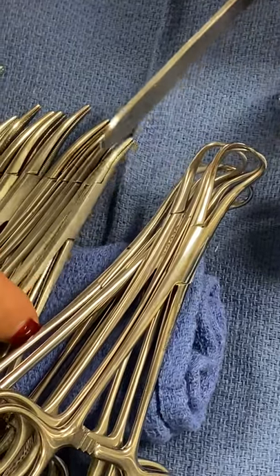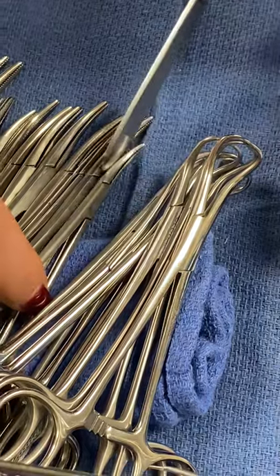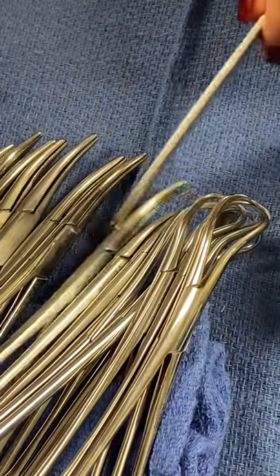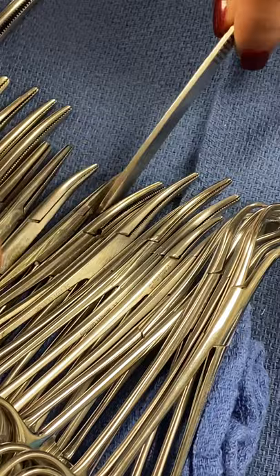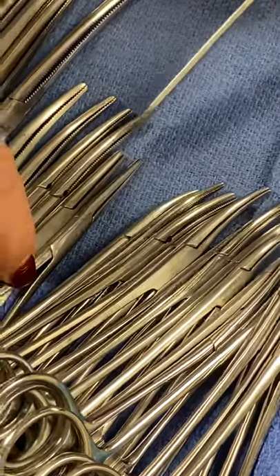Curved mosquitoes, one and two. Curved mosquitoes, two. And then curved hemostats, one, two, three, four, five, six, seven, and eight. Eight curved hemostats.